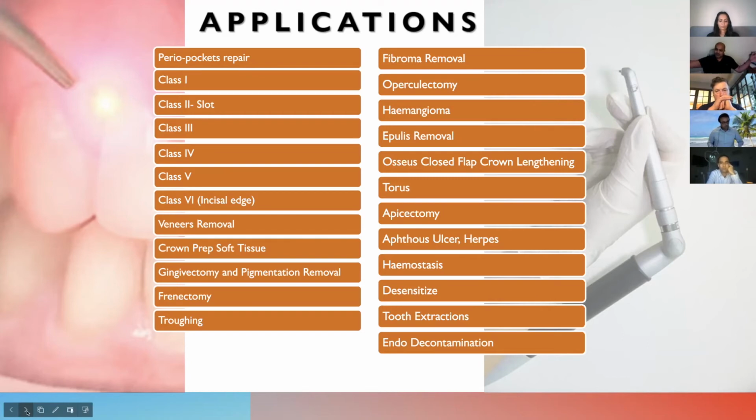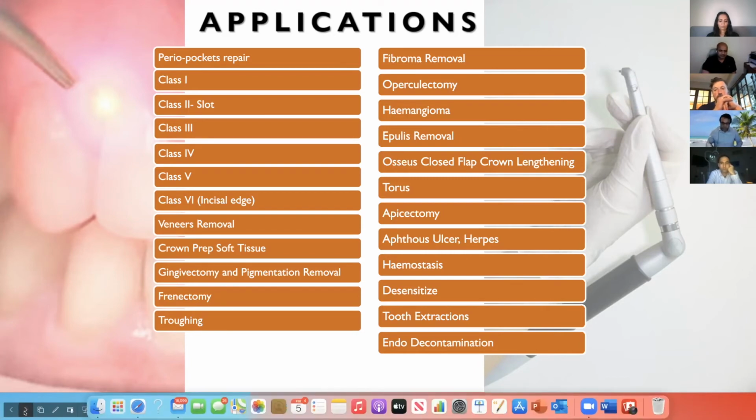And as soon as the power is weak, the whole functionality of that beam is not good anymore. So it doesn't do any destruction to anything. Okay, so it's very selective. Okay. Yeah. Okay. That's pretty much.